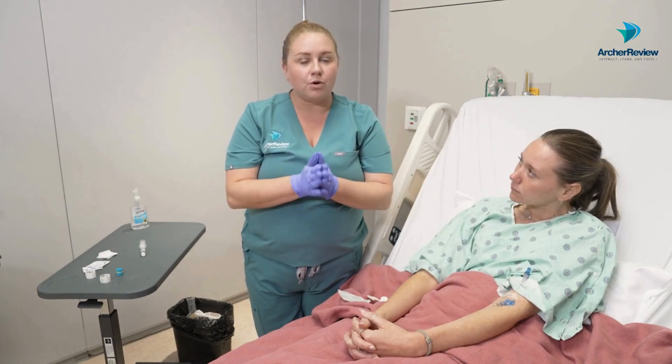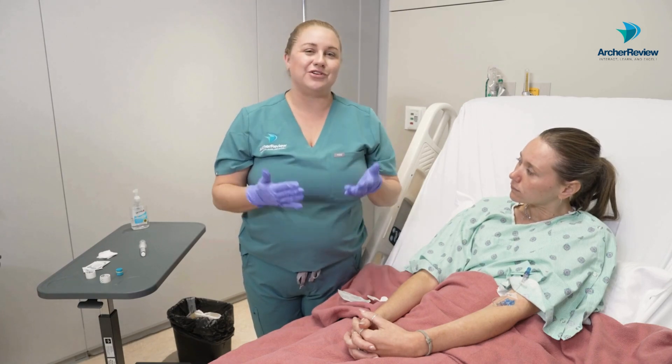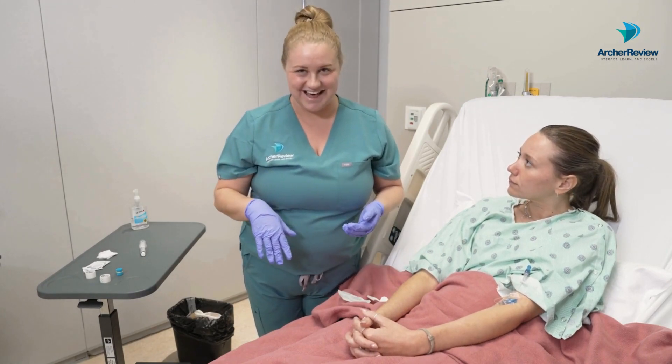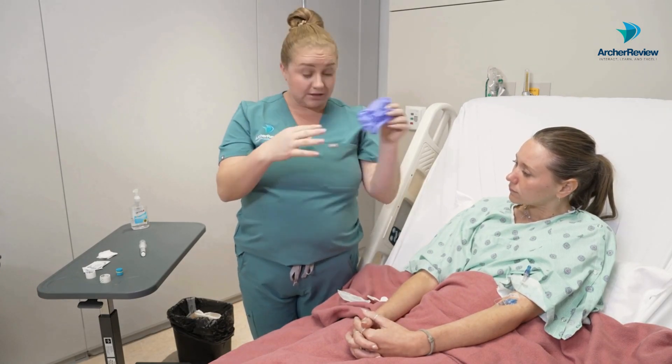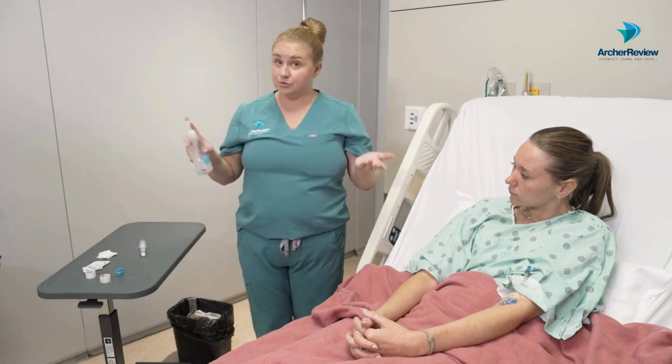Always follow your facility protocols regarding the frequency of dressing changes. But know that if they're soiled, you can make the nursing call to just go ahead and change that. Let's go ahead and dispose of our used gloves and our dirty supplies, then do more hand hygiene.